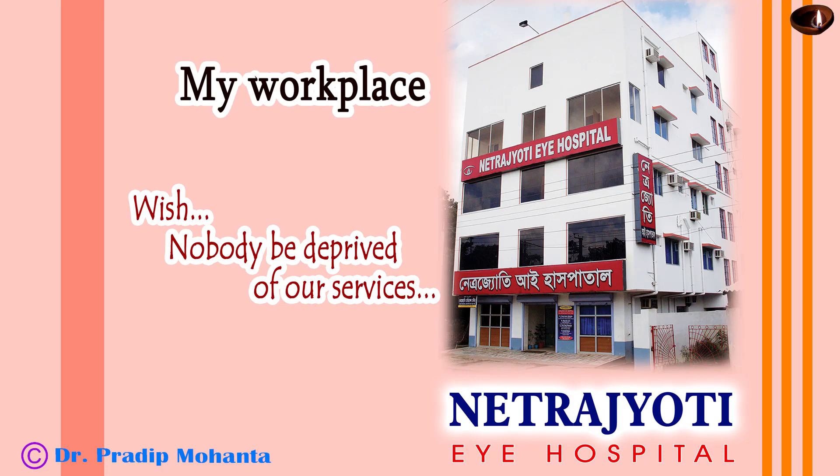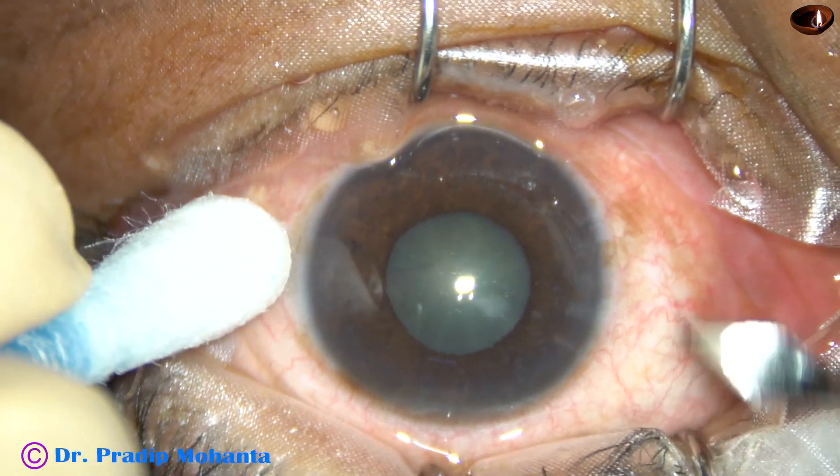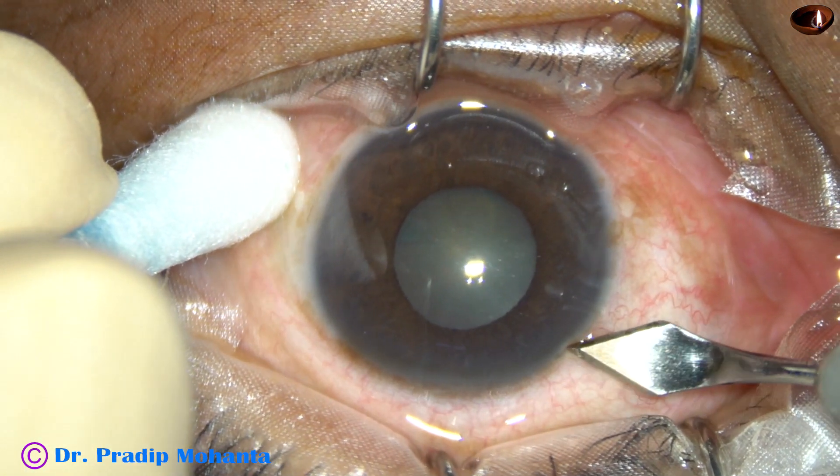Dear colleagues, welcome to my workplace at Ranaghat, West Bengal, India. This is a small pupil phaco. Let us observe the surgical steps.